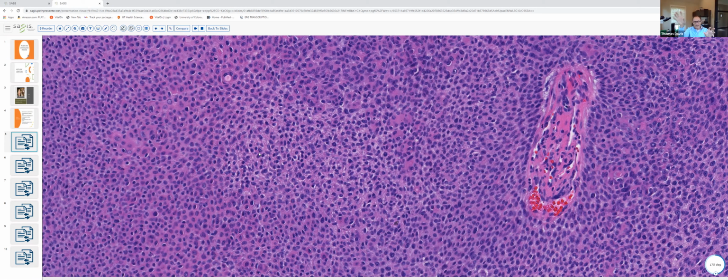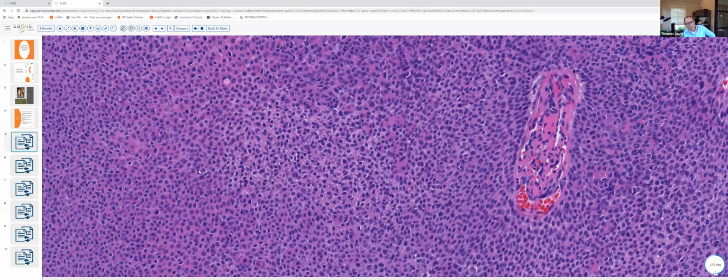So we've got eccrine acrospiromas that show differentiation towards the intraepidermal portion of the eccrine duct. And in that group of tumors, we have poroid tumors. The dermal duct tumor is one of those, and our hidradenomas. Now, what are the other family members of a dermal duct tumor?